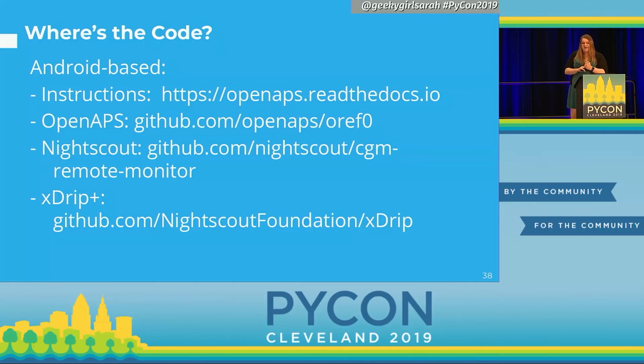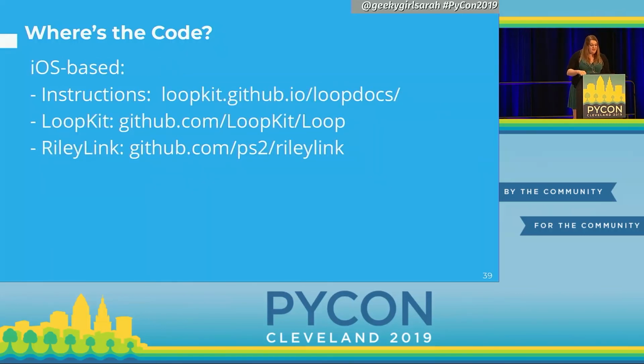OpenAPS, Nightscout, and Xdrip are all on GitHub. If you're doing the iOS-based system, all the instructions are there too. There's LoopKit and RileyLink. RileyLink's the hardware board that does the communication. So they've open sourced that as well, which is really cool.